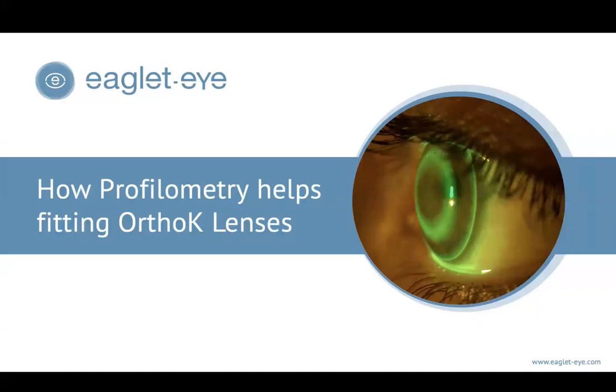We use profilometry as well to fit OrthoK when we're in the clinic. So just remember that profilometry is not just for fitting sclerals. Algorithms have been really getting better and better when it comes to fitting OrthoK.